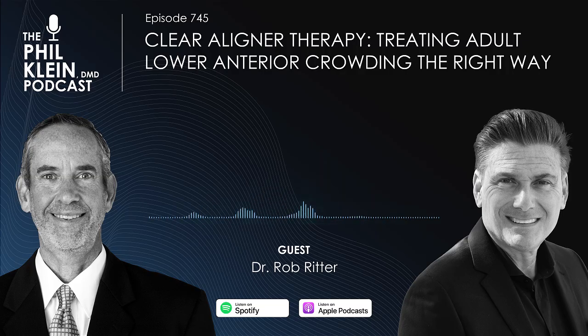Does it take a little bit of knowledge to do that and understand the controls? Because basically, you're doing the orthodontics on the screen before you hit send to produce the trays in succession. You didn't have those control systems 10, 15 years ago. And so I think for us now in dentistry, because of the advent of AI and the technology, the workflows, it is making things so much simpler than ever before to get a quality product for your patient.